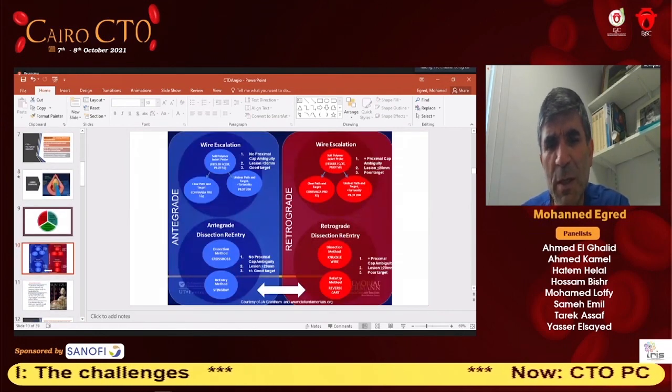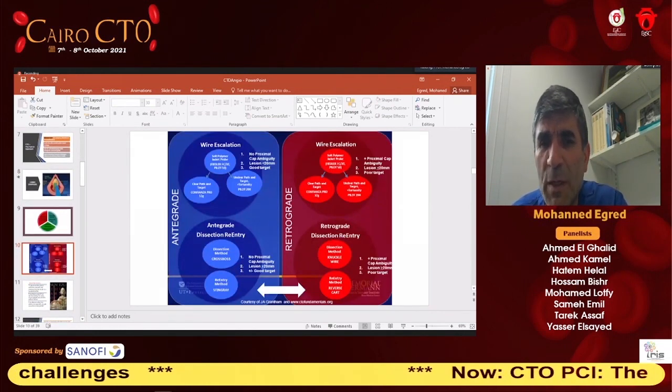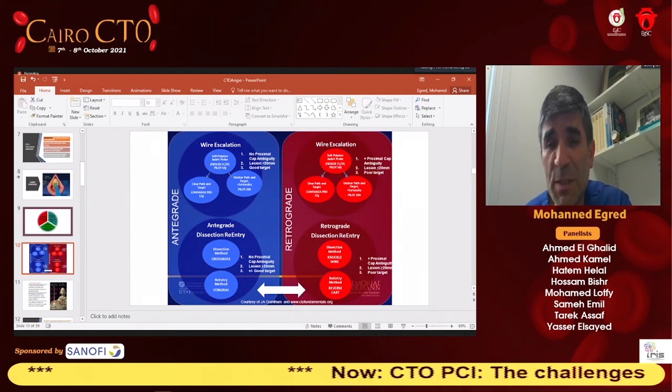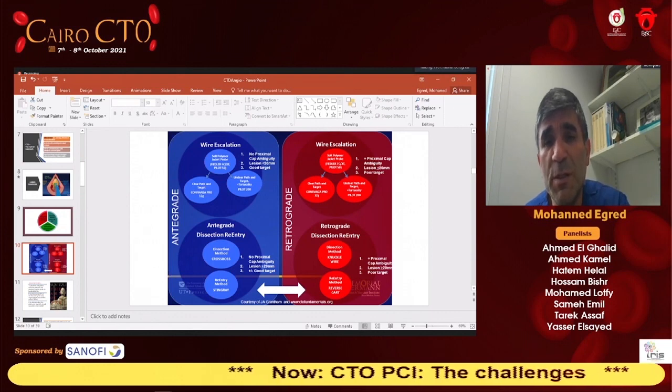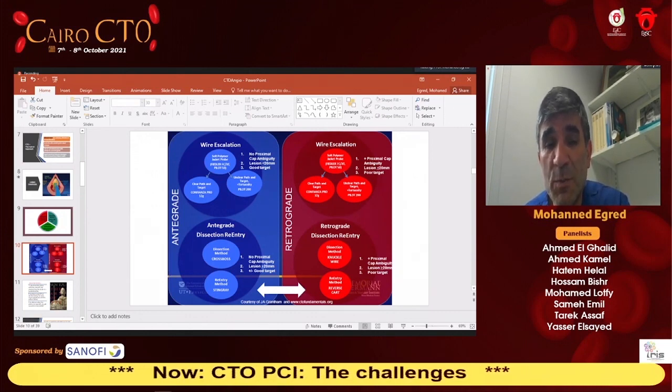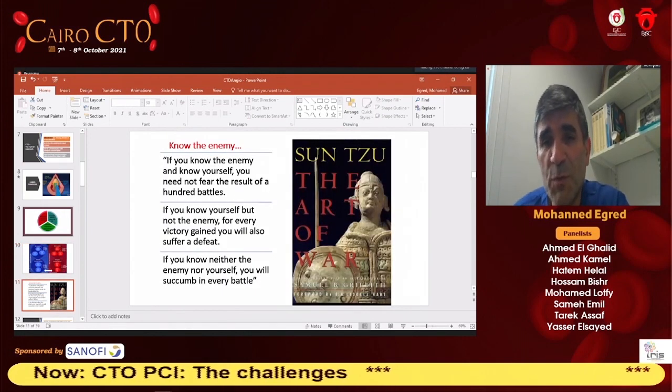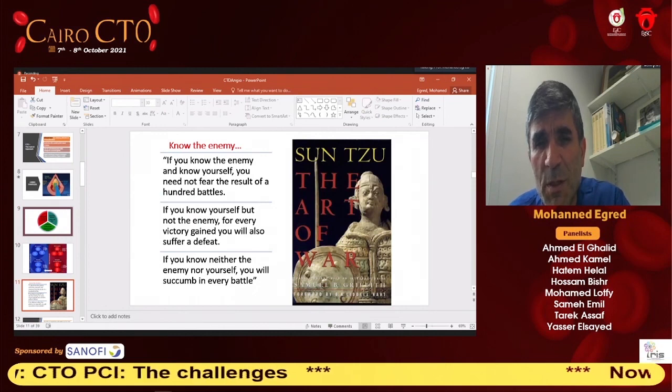And as you could see, it is a complicated way until you master it. So in order to be successful in dealing with CTOs, you really need to know what you are looking for, and assess it to be able to devise a strategy. And of course, some of you might have read this book, The Art of War.